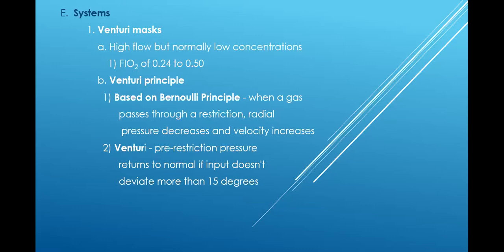Okay. And this is a very important principle that you need to know. This is where the air entrainment comes from. When I say that word air entrainment, it's like when you let the windows down and it sucks in all that outside air. That's called air entrainment, E-N-T-R-A-I-N-T. You know, I'm not a speller. Entrainment. Figure it out. So when I pull in air from outside, I'm pulling in outside room air, right? 21%. And that will decrease the FiO2 that I have, right?